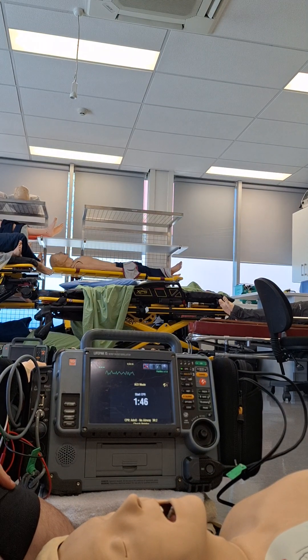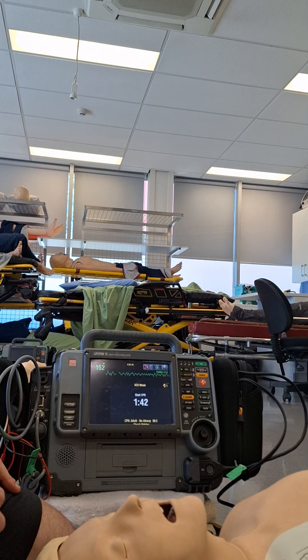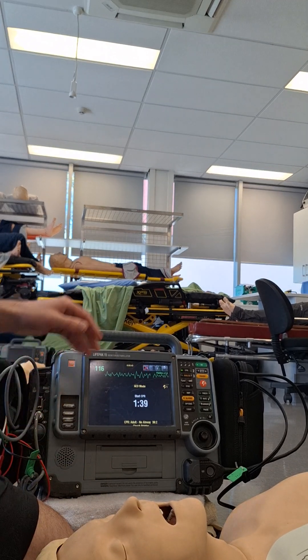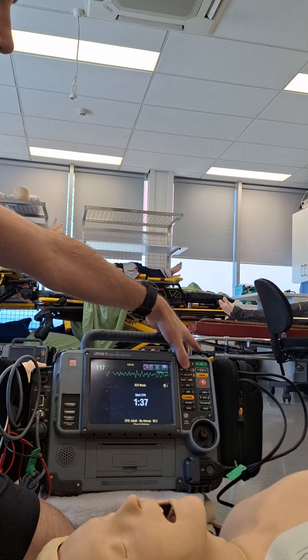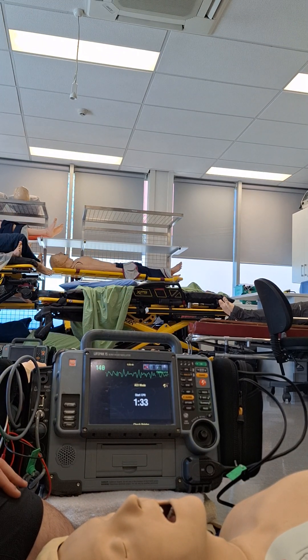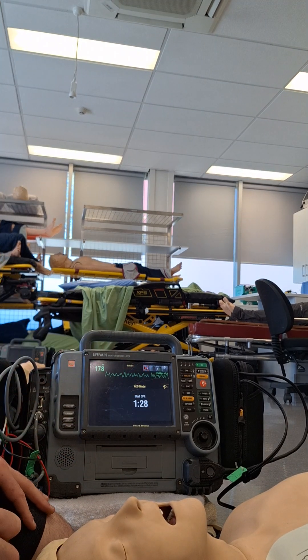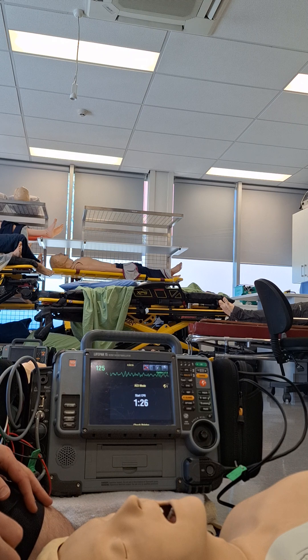Now quirks of this monitor: we've got this CPR metronome that started automatically. So one of the first things I'm going to do is switch that off by pressing the CPR button, and I'm going to replace it with my own metronome. We've got our CPR timer up on the screen that we're going to use to keep track of our CPR cycles.